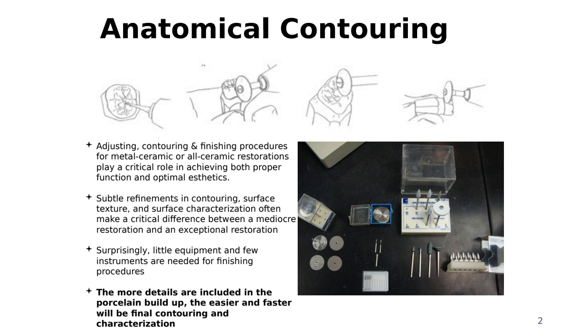But now we have to do the function, right? So we're using articulating paper to see where the contact areas are, how the contact is, and if we need to grind something. So we're going to talk about all those steps that we need to take. But that's very true. We can take our time to do an exceptional restoration where the patient cannot tell which one is their natural tooth and the crown that we did, or a generic crown, which is a crown we just did there.